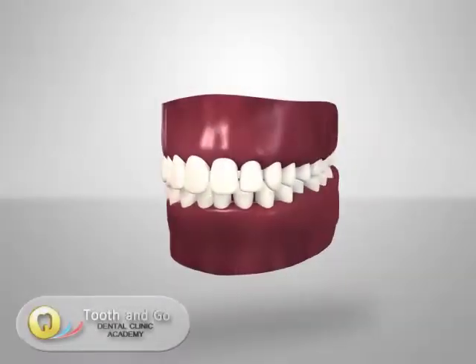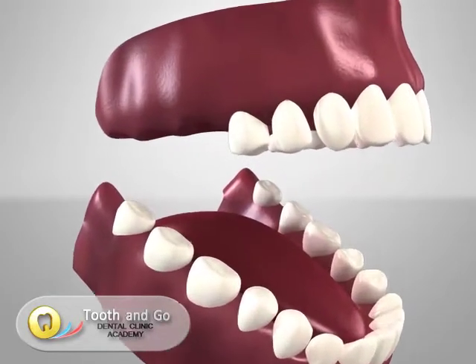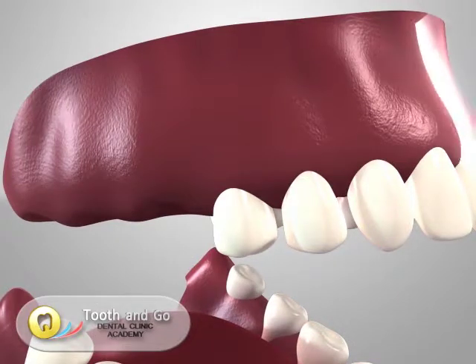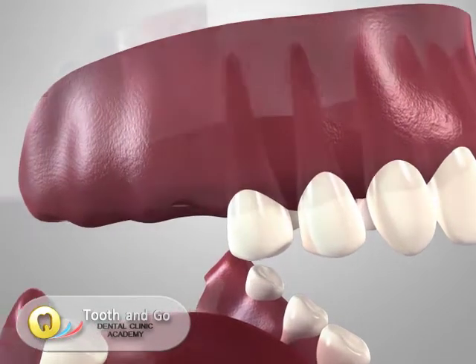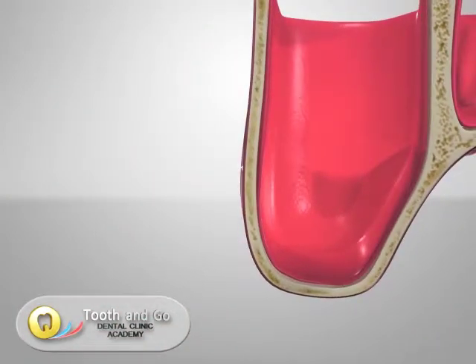In this video, we will describe a sinus lift augmentation — a procedure to augment the bone of the sinus cavity to allow implant placement in an area where there is insufficient bone. The sinus cavity is typically located at the back area of the upper maxillary arch.